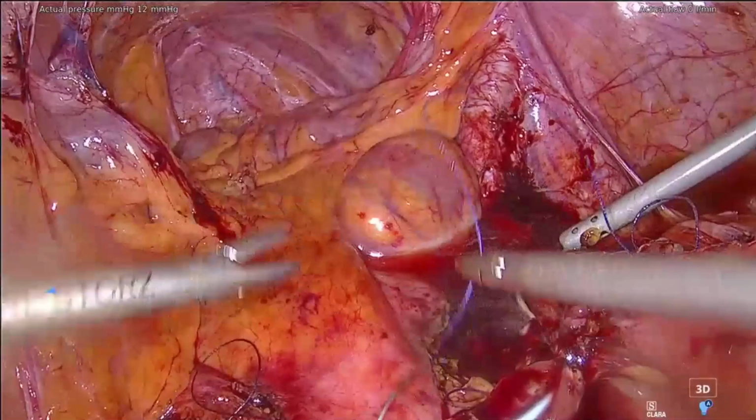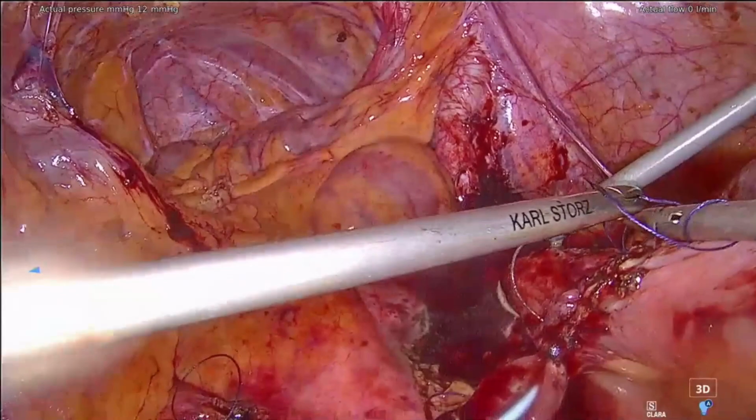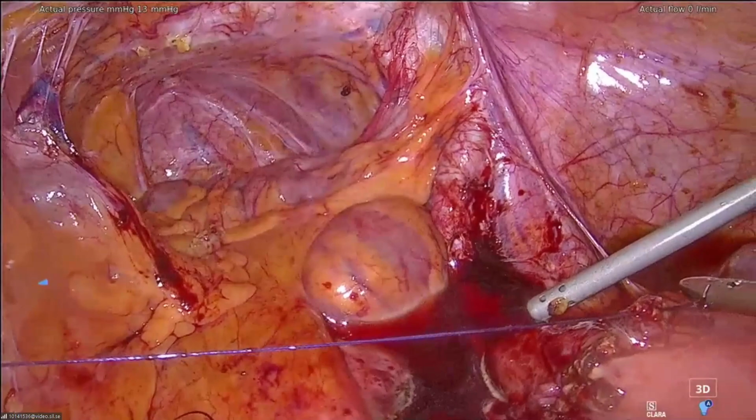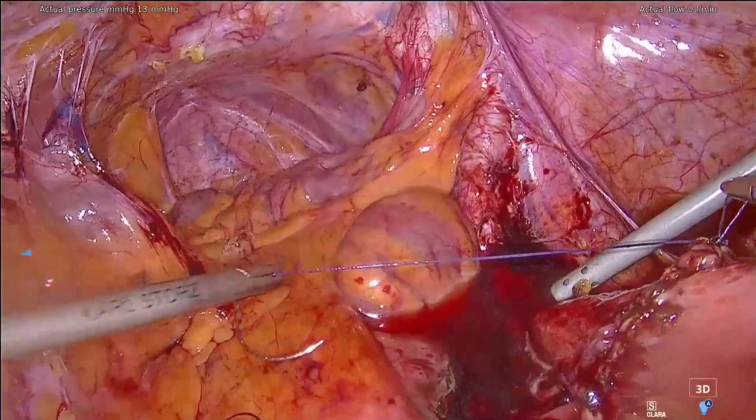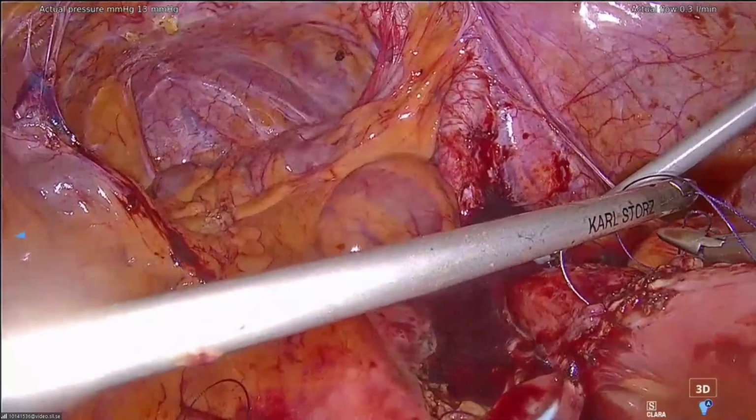And if I have to operate on my father, I put a drain. And I operate on my patients like they are my father or my mother. Not my wife, but like my father and my mother. And then I put a drain. I think that is safer. No, I'm joking. I hope that she never hears that video. Sorry for you, we recorded you. Okay, we can cut this already.